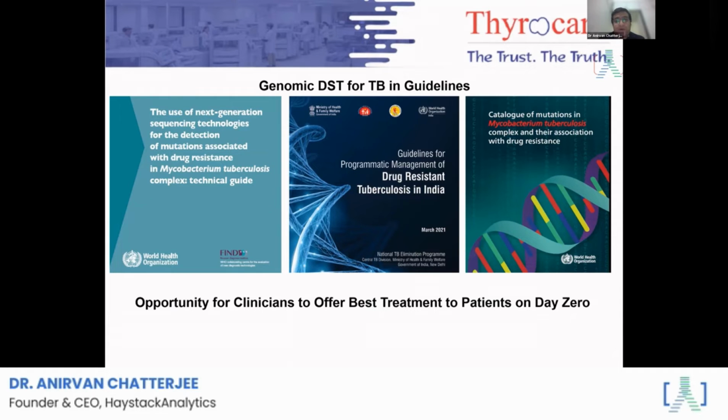The government of India, the programmatic management of drug-resistant TB. And this is really, really critical because we're talking about India, we're talking about India's healthcare system, and we're talking about tuberculosis. We all think that we are not working in that aspect. And this year, the tuberculosis elimination program in India has already put out next generation sequencing as one of the key technologies that will be onboarded in the TB elimination program in India. As far back as 3 years back, the preparations have started with 6 sites in India already doing TB genome sequencing to understand its implications on surveillance, to understand its implication on drug resistance.